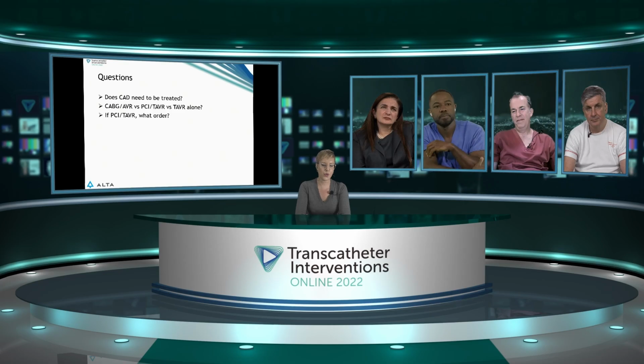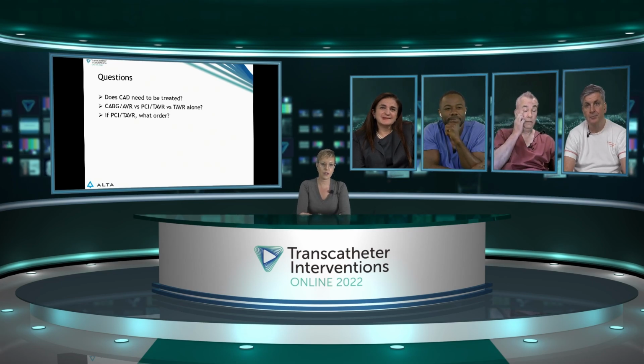Yeah, I think this is a great time to dive into that a little bit more. Roxana started this afternoon with a presentation on this topic. So Roxana, does it need to be treated at all, that proximal LAD lesion? Yeah, I'm actually more concerned about that anomalous circ and access to that anomalous circ post TAVR, that might have an issue down the line. But I also am worried about that proximal LAD.